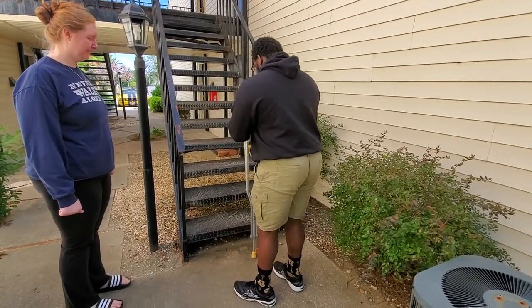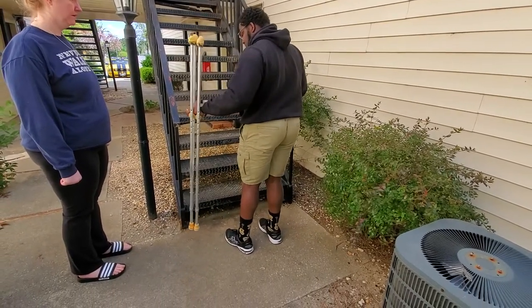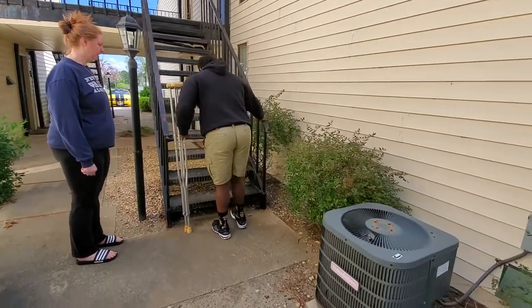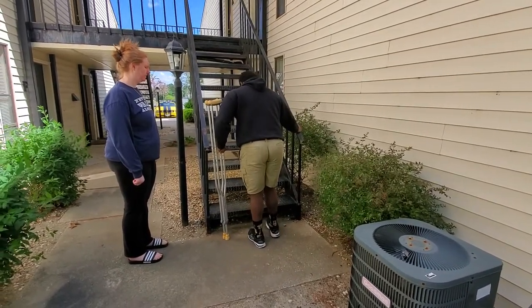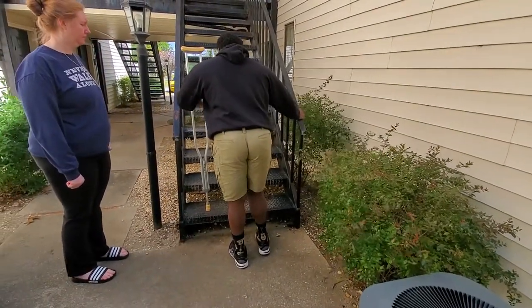You're going to go up first with your good leg, and you're going to put the crutches on the side that your good leg is on. Keep minimal weight on the surgical leg. Use your arm on the surgery side to balance yourself on the rail. Grab that rail, step up with the crutch, and pop up with the leg you had surgery on.